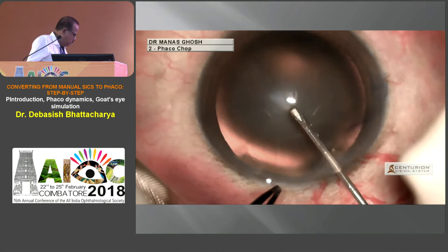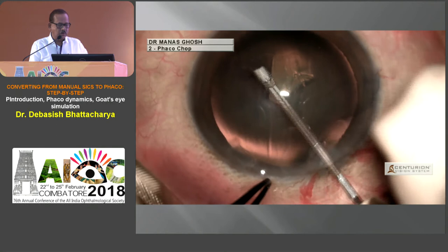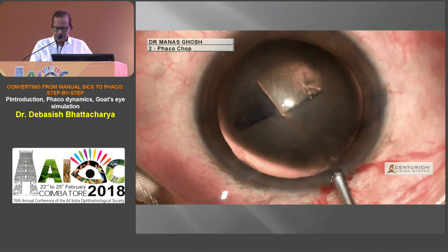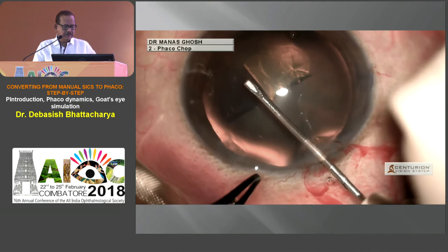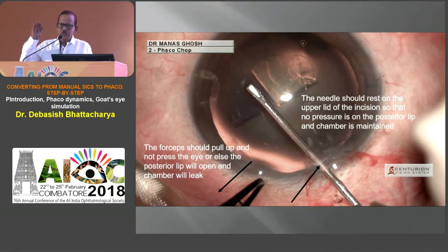Rexis is a fairly simple step which all of us know. We need to turn the rexis, catch from near the rexis, and what is important is you need to refill whenever the chamber goes away. In SICS when we lift, the incision closes — same is with the posterior lip — so when using the needle, rest it on the upper lip of the incision. That is how you can retain the viscoelastic, which we don't get heavy in our context. If in apprehension you press the forceps down, you actually lose the viscoelastic.